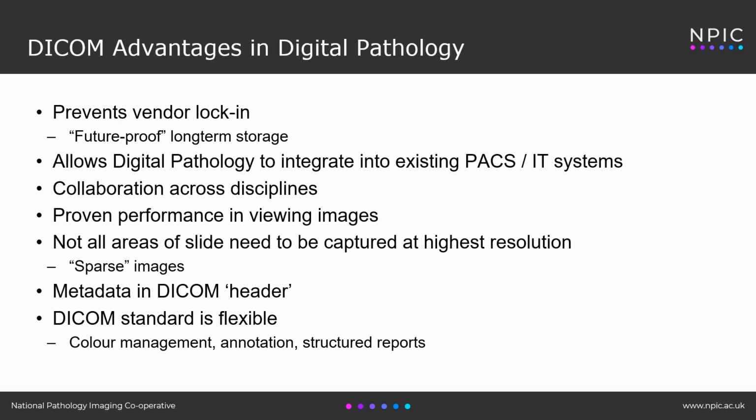As we've already said, not all of the area of a slide needs to be captured at the highest resolution, so-called sparse tiled images, which means that there's more efficient use of storage. And importantly, the metadata can be stored in the DICOM header, particularly important for AI applications, but also important clinically if you were sharing a particular digital slide with colleagues in a different hospital, for example. And lastly, the DICOM standard is flexible. Things like colour management, annotations, and even structured reports can all be stored within the standard itself.